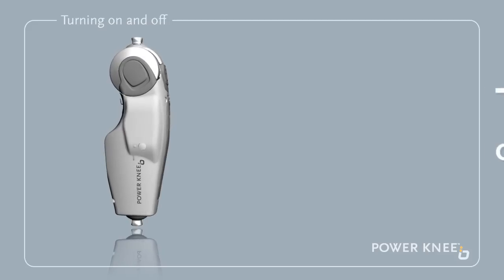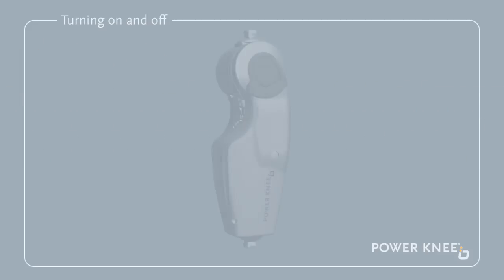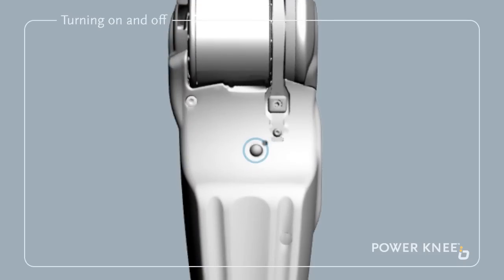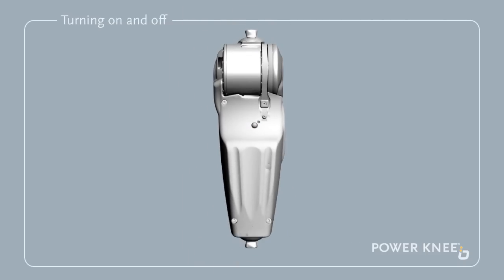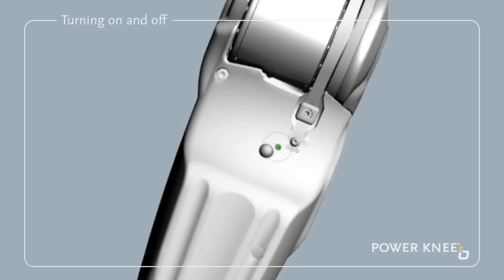Turning the Power Knee on and off. To power up the knee, press the on-off switch button at the rear of the prosthesis. The knee vibrates and a three-tone ascending beep can be heard. Then a green light flashes slowly, indicating that the power is on.